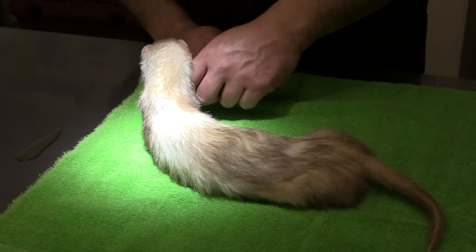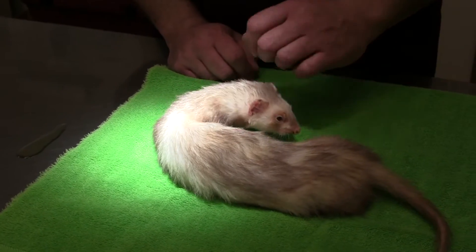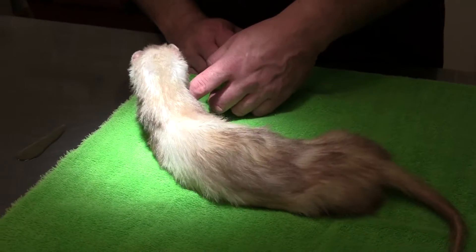So this is Blossom. She is a five-and-a-half-year-old spayed female ferret, and she needs a deslorelin implant, so we're going to do that.